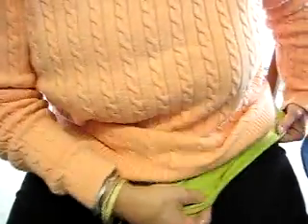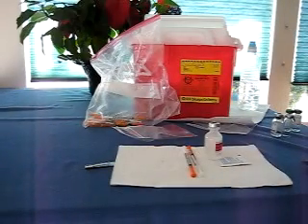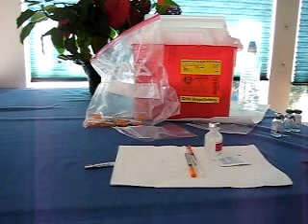Did that hurt? Didn't hurt a bit. I don't think there's a single nerve in that belly fat — I never feel a thing. Needles and giving an injection — part three. I went to the doctor the other day, had to learn how to give myself subcutaneous shots, and so many people asked me about it I thought I'd share it.